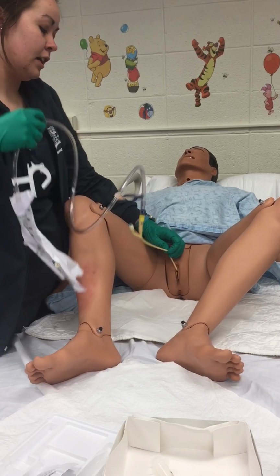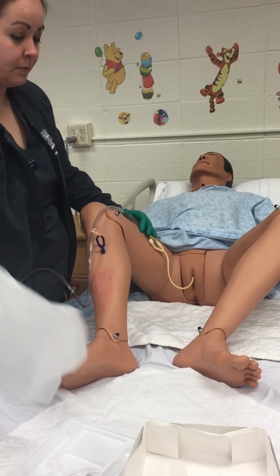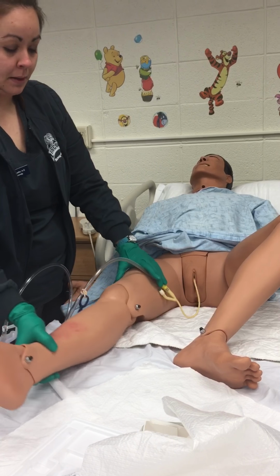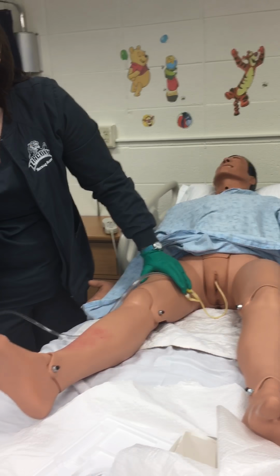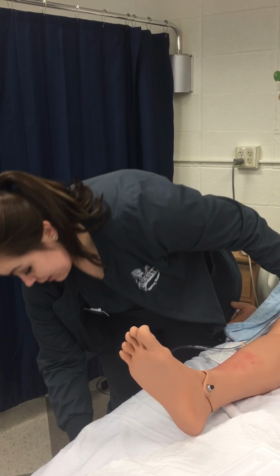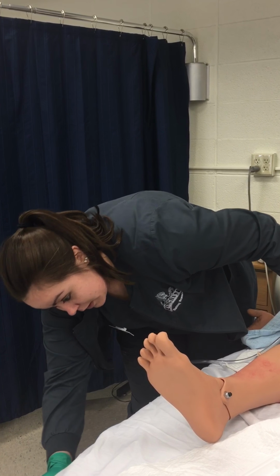Once that is done, I would take my Foley and I would attach it to a clean part on the patient's leg, return my patient to a comfortable position, and keeping the bag lower than the level of the bladder, I would attach it to a non-movable part on the patient's bed, making sure the tubing is not kinked.